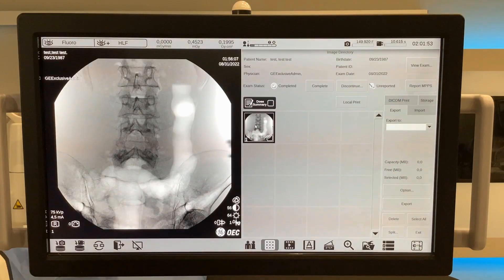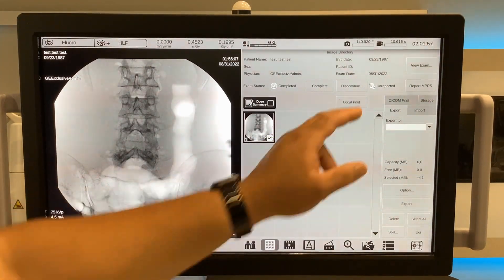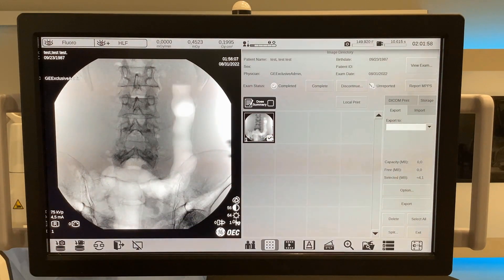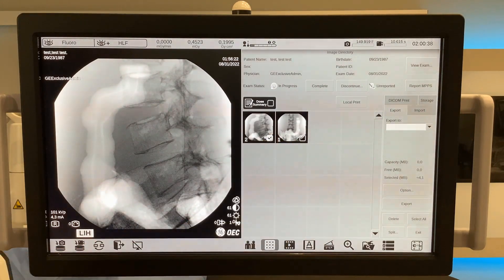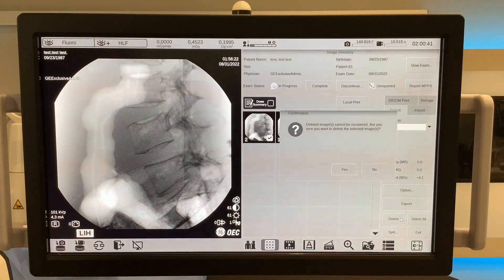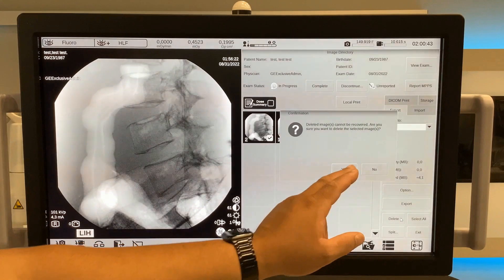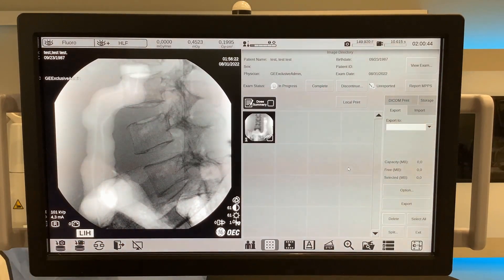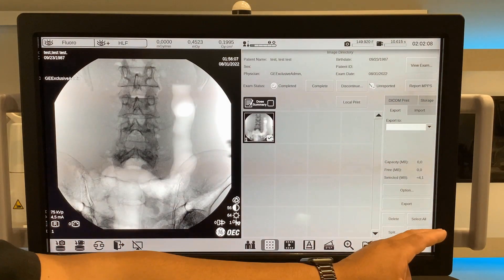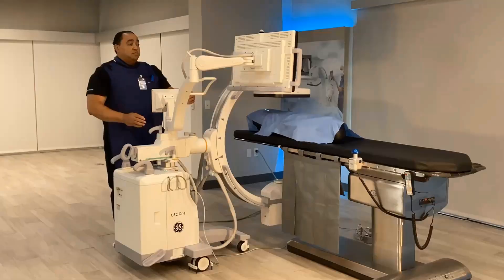If a printer is configured with the system, select the image you desire to be printed and select local print. To delete an image, select the image and select delete. A confirmation message will pop up. Deleted images cannot be recovered. Please select yes. Exit when all actions are complete.